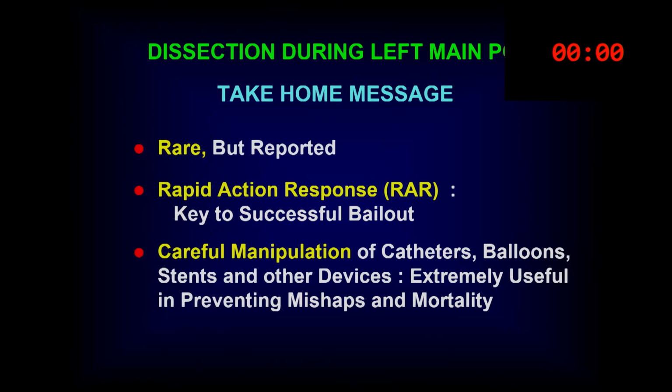So the take-home message is that rapid action response is the key to success in these patients. Careful manipulation of catheter, balloons, stents, and other devices is extremely useful in preventing mishaps and mortality due to left main dissections. Thank you.